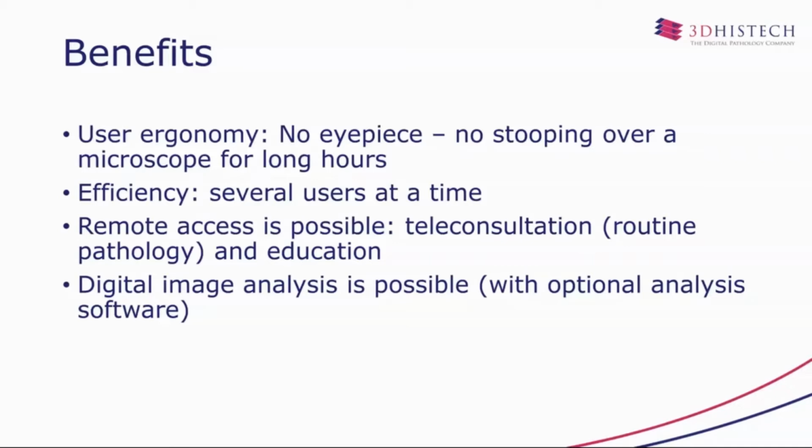First of all, it's user ergonomy. There is no eyepiece, so there is no stooping over a microscope for long hours, so it's good for the back and the neck of the pathologist or the researcher or the student. Number two is efficiency. Several users can view the same slide at a time. Obviously, it makes it very efficient.